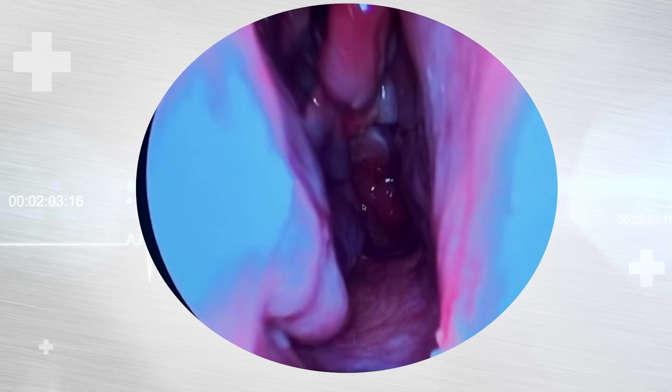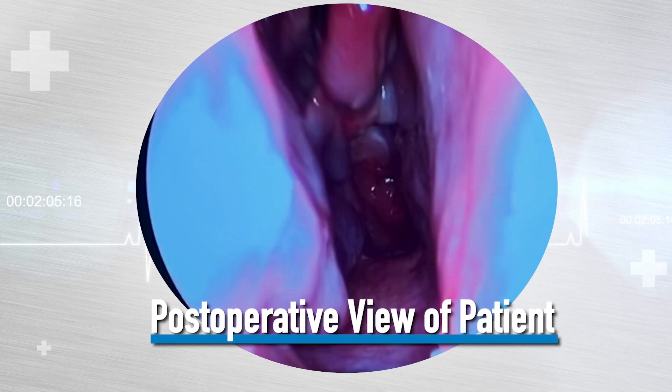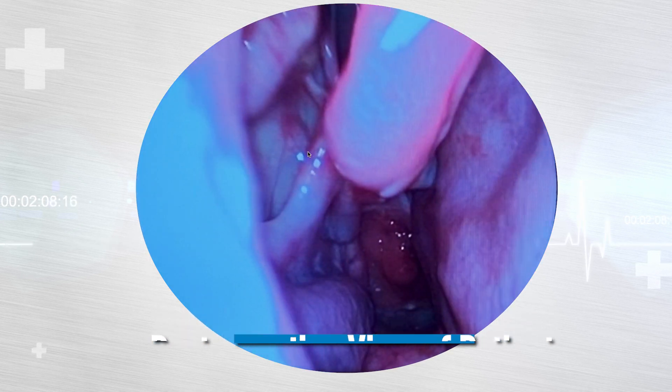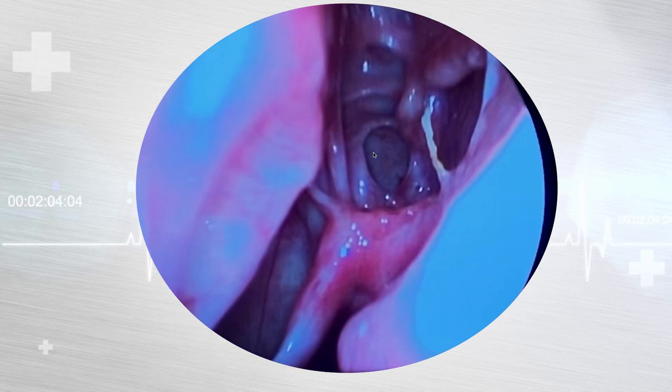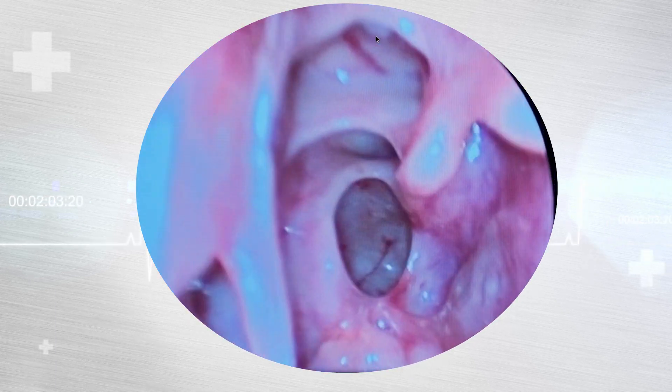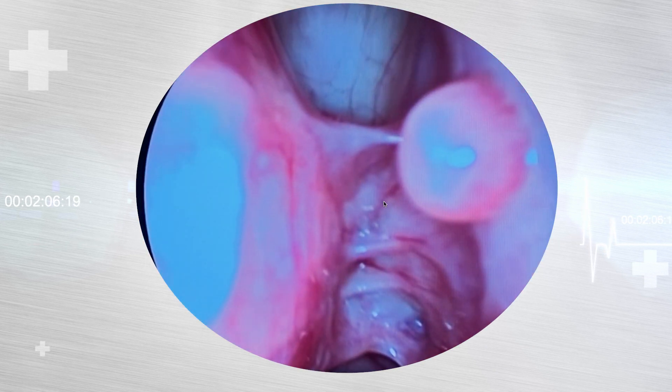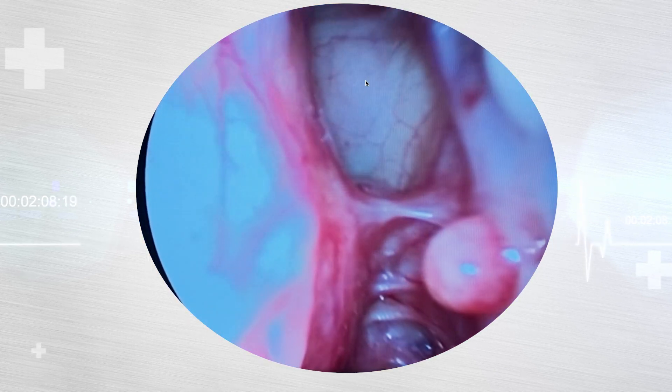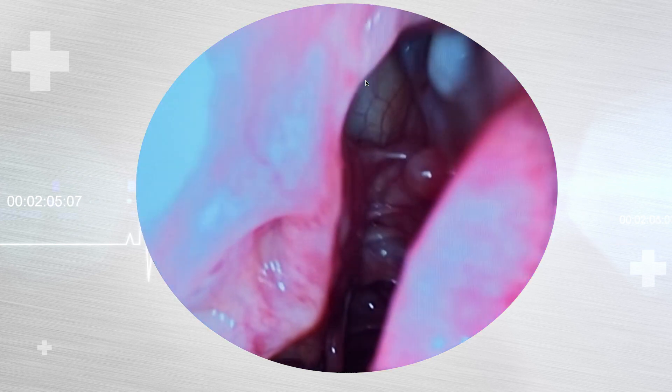So what do we do for this patient? We took him to surgery, cleaned out all the polyps, and then opened up his sinus cavities. This is a completely open right nasal cavity. Here's his middle turbinate right here. Here's his right maxillary sinus, his right sphenoid sinus wide open. Here's his skull base. Now we're going to look up towards his skull base — there's his frontal sinus. Not only can he breathe better, but he feels more open and he can taste and smell. And if we repeated his CT sinus, all of his cavities would be black instead of gray because now they're filled with air.